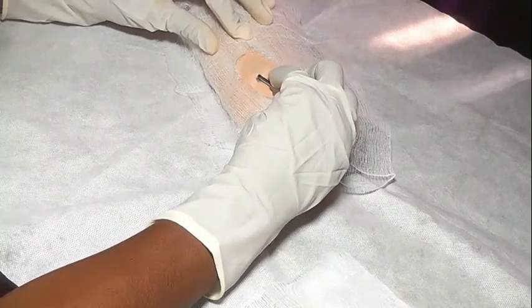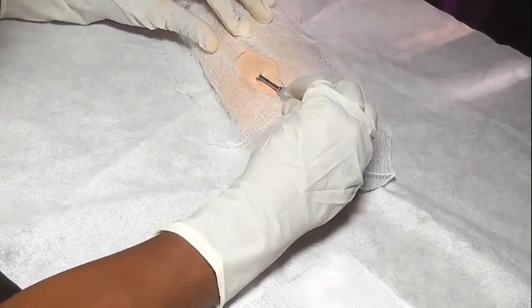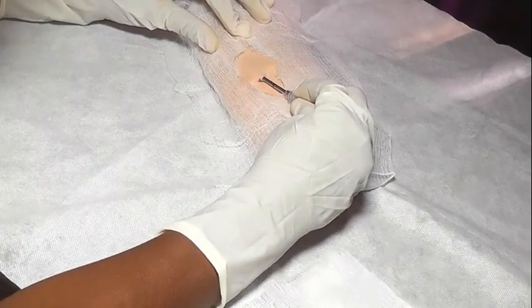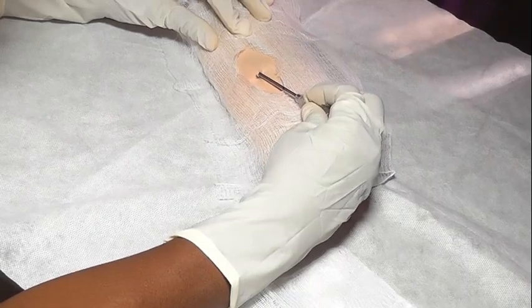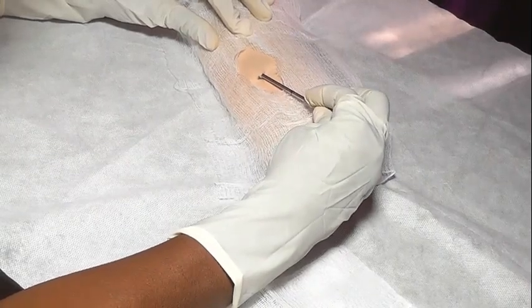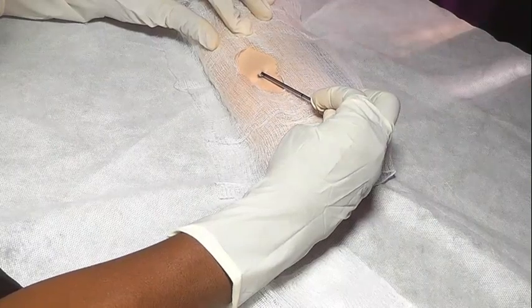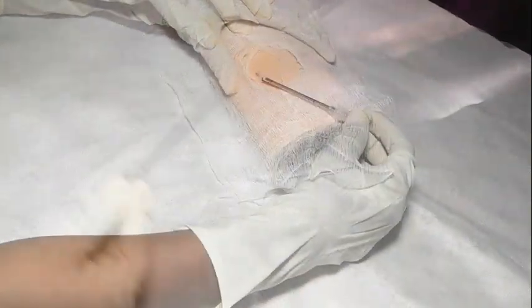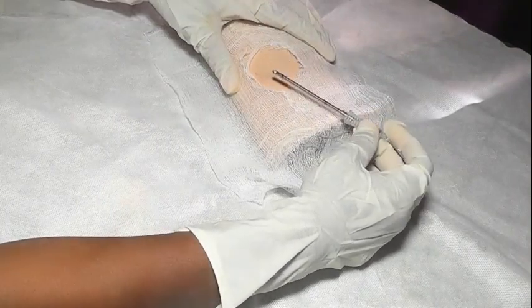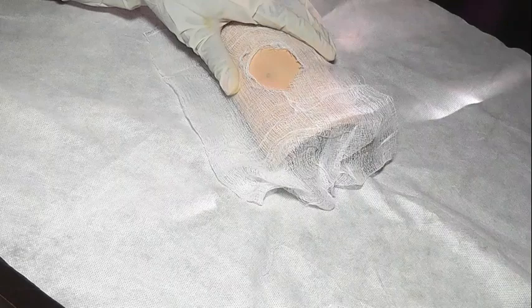In the same way, I'll continue to withdraw. I'll withdraw the trocar as a whole. So this time around, I'm going to completely withdraw it because I've finished introducing the 2 rods. Okay. You can see, after successfully removing the trocar, you discard it into the injection safety box.